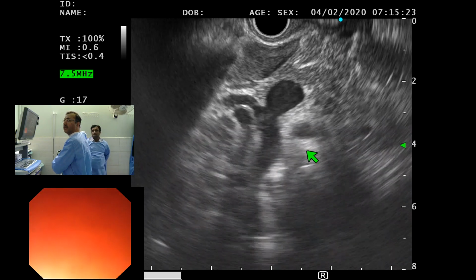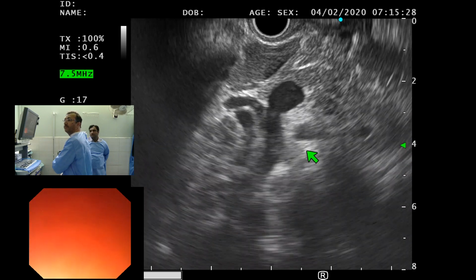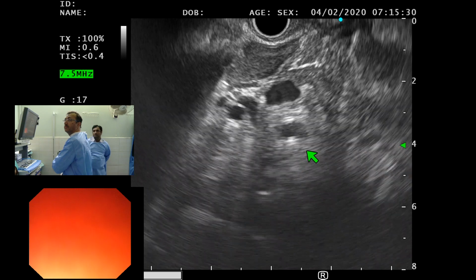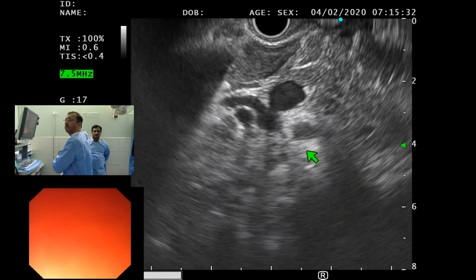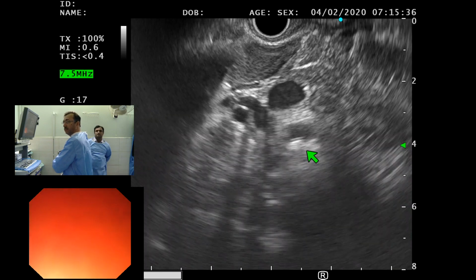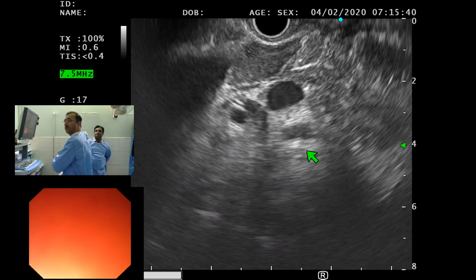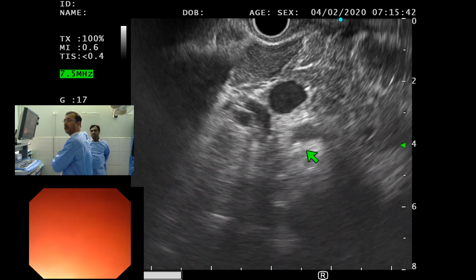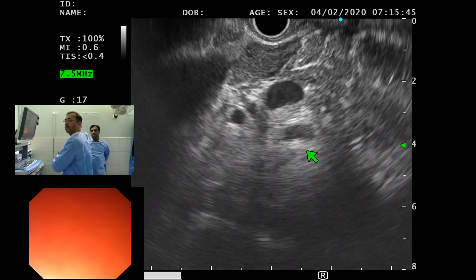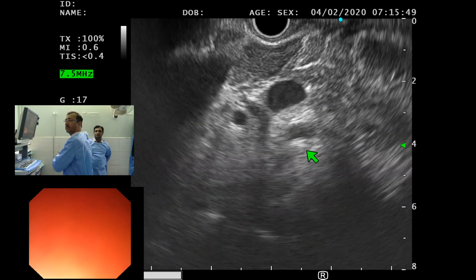Sir, in a patient like this, how many passes will you like to make? Riyas, usually I'm guided by what comes out and what they tell me after the evaluation. But I think, with the way you went, at least 2 passes. Usually 2 to 3 is what we do, but it depends on whether we've got the sample and we've got the cells on the microscope.